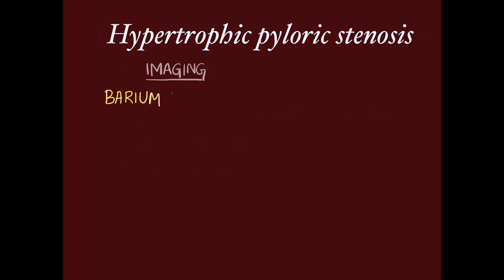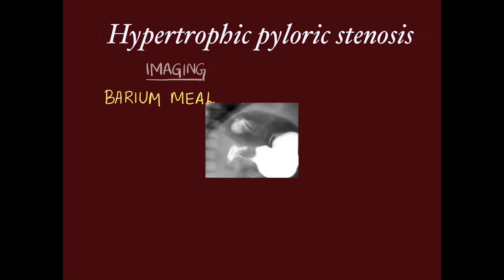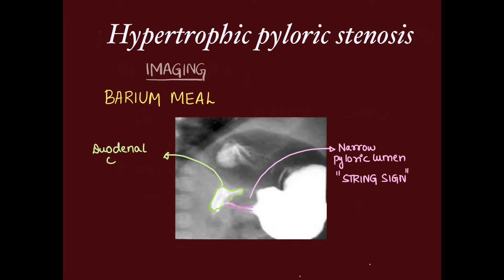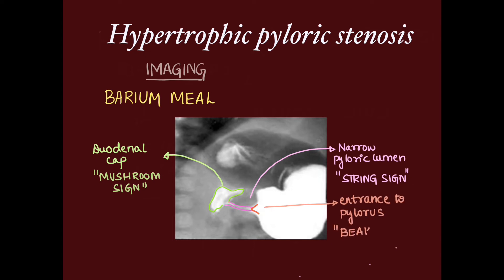On barium meal study, various signs are described. We can see a narrow pyloric lumen, which is called the string sign, and the duodenal cap filled with barium, called the mushroom sign. The entry to the pylorus is beak-shaped and hence known as the beak sign.